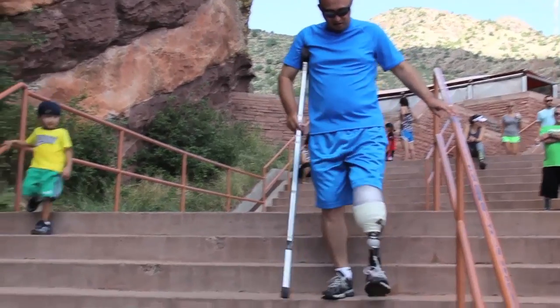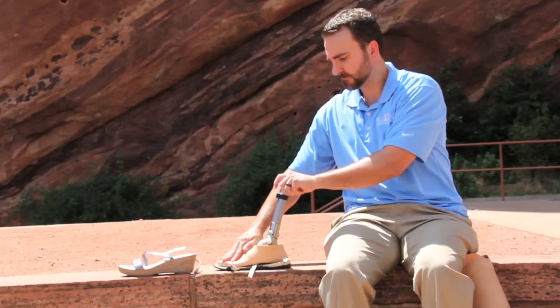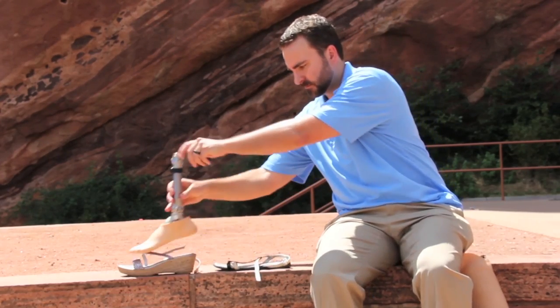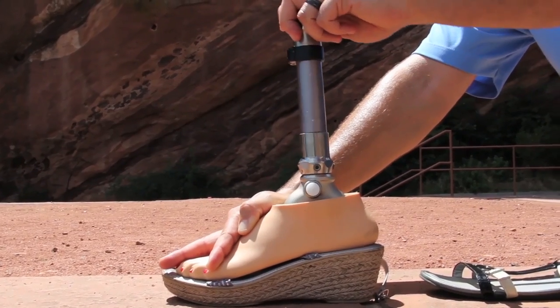Some feet are specifically designed to accommodate different heel height shoes, which makes this a lot easier. But most of the more dynamic feet are not. However, there are some tricks you can do with wedges.